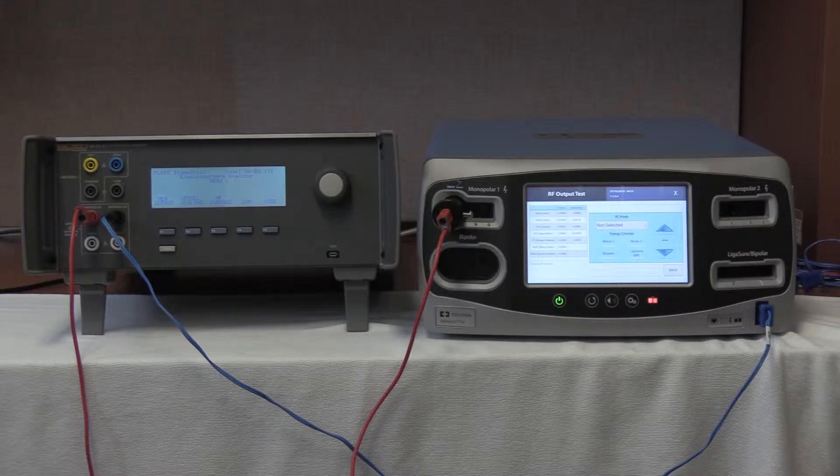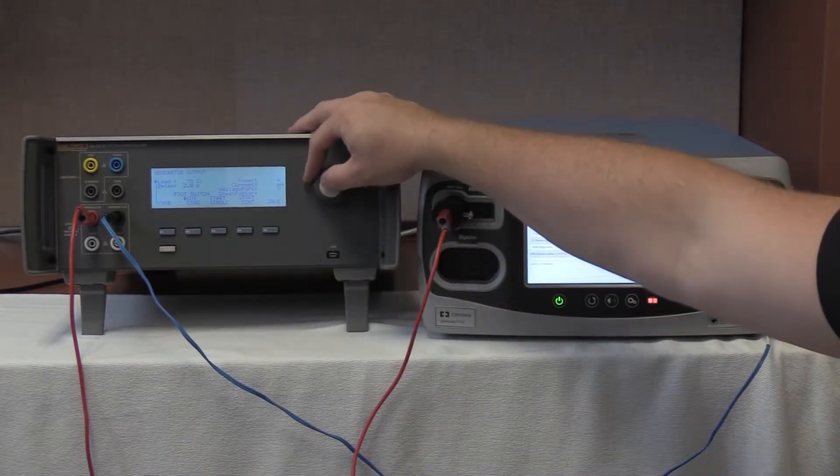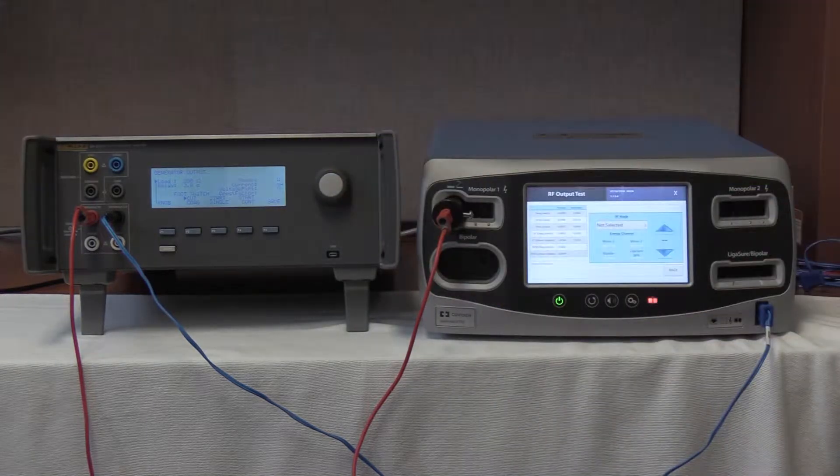Once selected, we are going to select generating output of the QES-3 and select the 200 ohms load by rolling the knob up. Once 200 ohms is selected, we are going to go to the Valleylab FT10, and all readings should be between 0 and 150 milliamps.